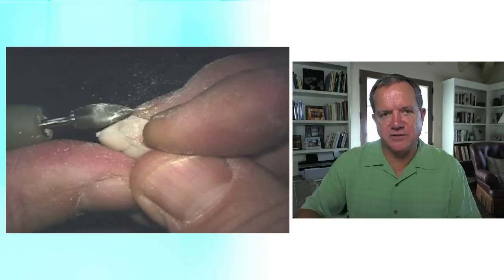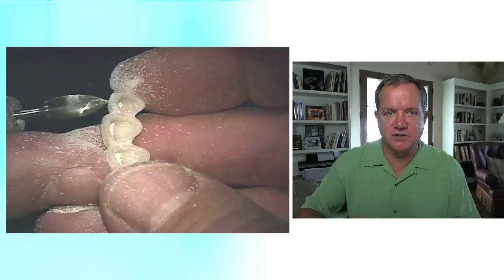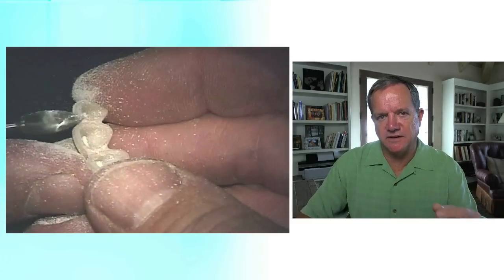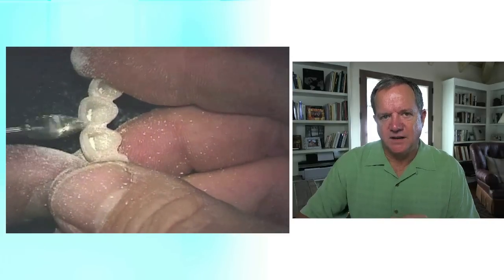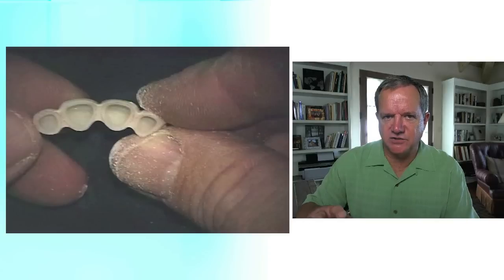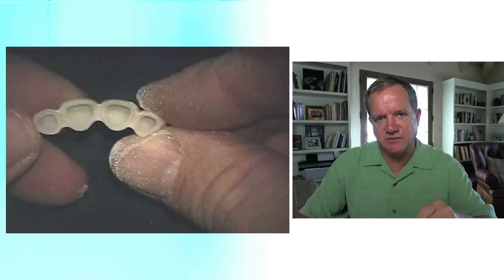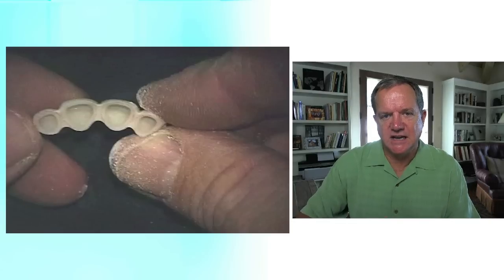You could reline in the mouth as well, but since you have a very nice model to work on, I'm going to do it directly on the model. Using the flame-shaped burr for the facial, lingual, and interproximal — once the facial and lingual looks pretty good, I want to make the margin fit well before final trimming all the embrasures. I'll air-abrade it with 50-micron aluminum oxide, paint some adhesive on it, and then use flowable composite just like injecting syringe material for an impression. We inject it on the margin of the model and then seat the temporary on it — you never want to inject into the temporary and try to seat it, you'll never get it to place.